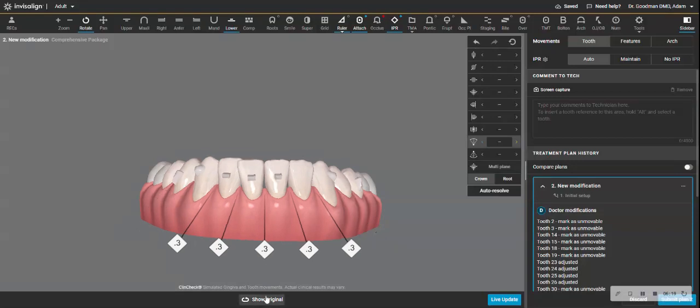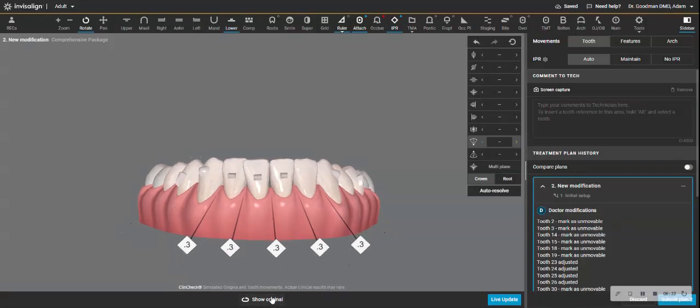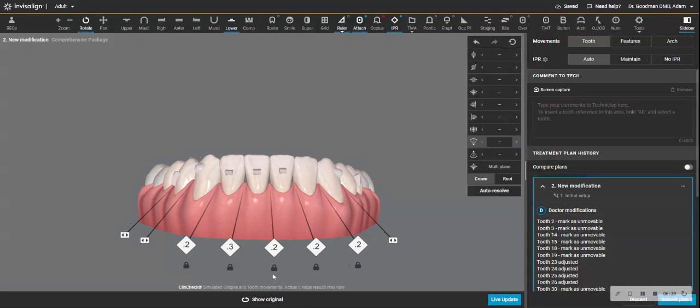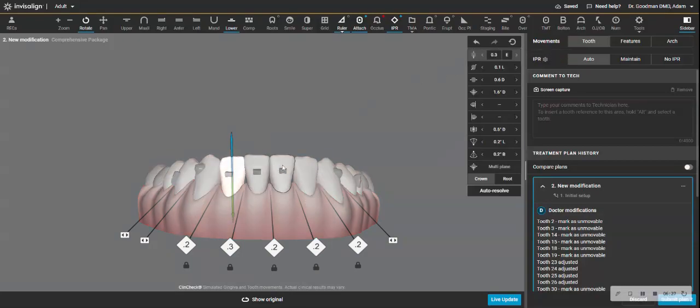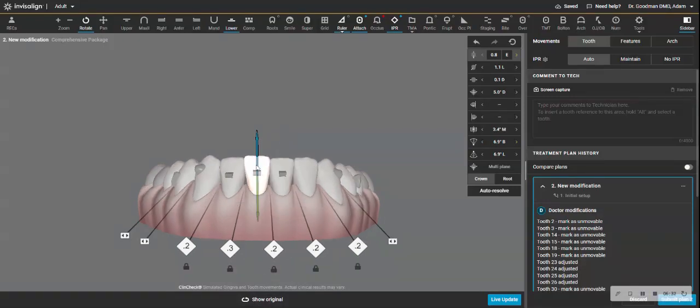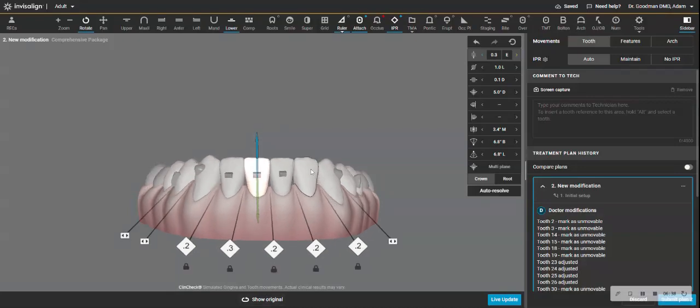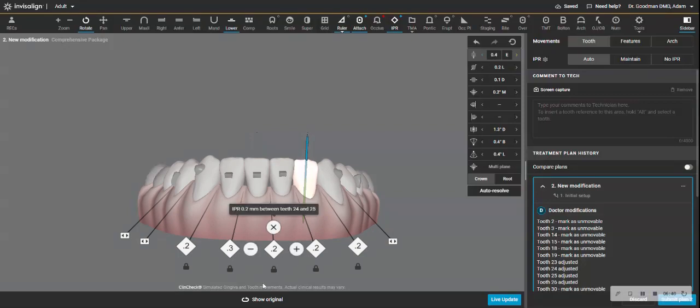Now the extrusion, do I need to extrude these teeth? Well, I'm going to extrude 25, but I try to limit extrusion wherever I can. So I'm removing the extrusion on the teeth that don't really critically need it.